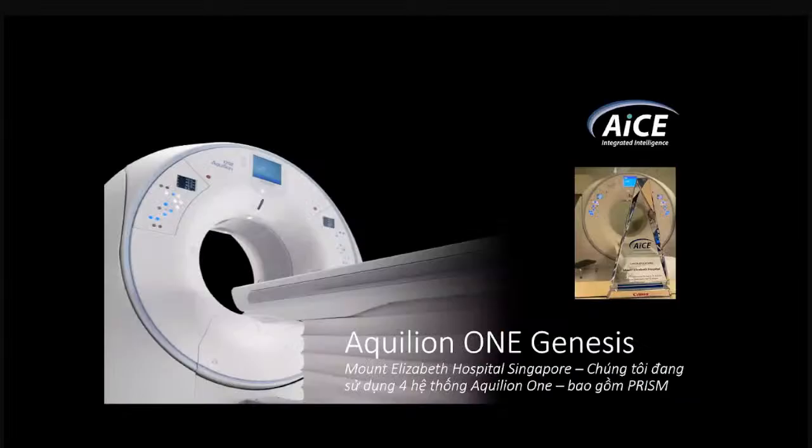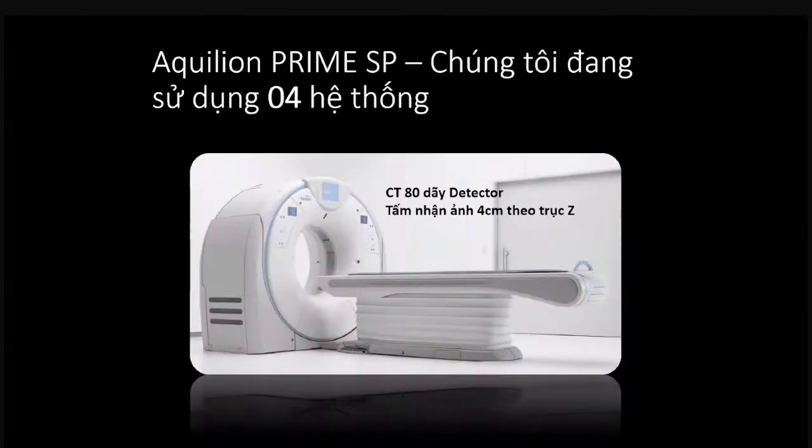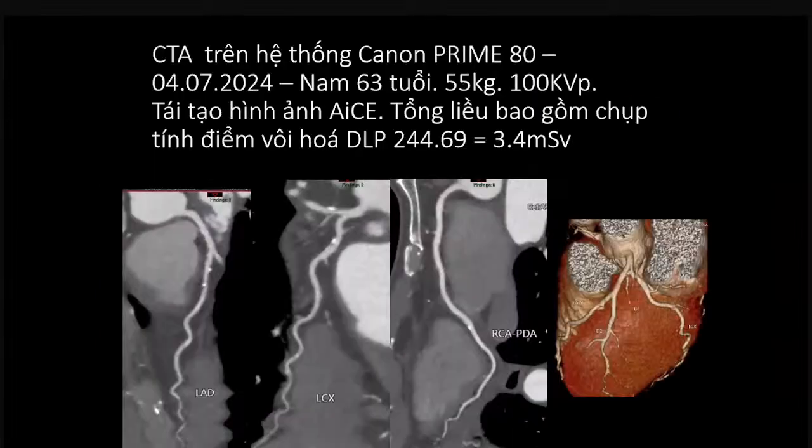In our hospitals, we operate 4 units of Aquilion. So here's an example of a CT scan of the coronary arteries performed on the Prime 160 slice CT scanner in July this year. 63-year-old man, 55 kg.